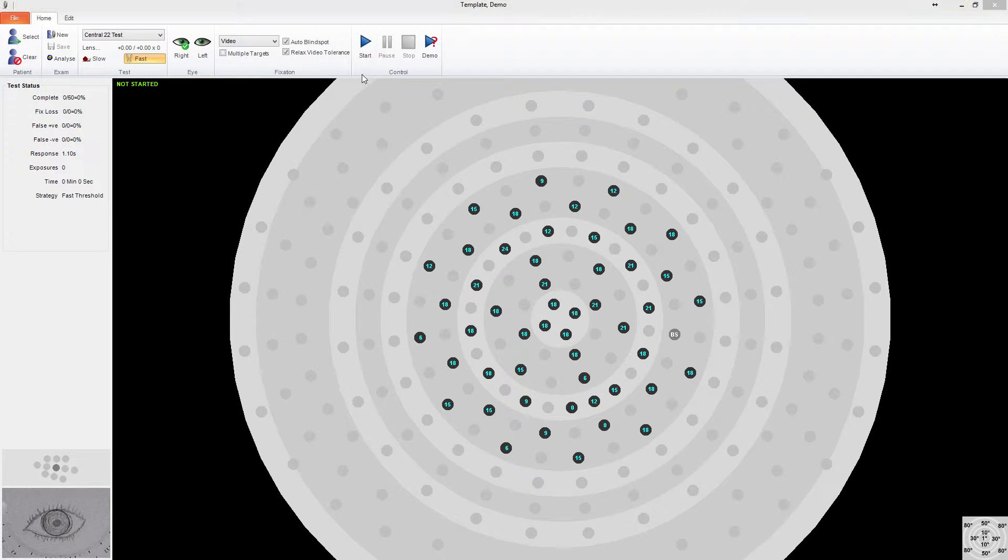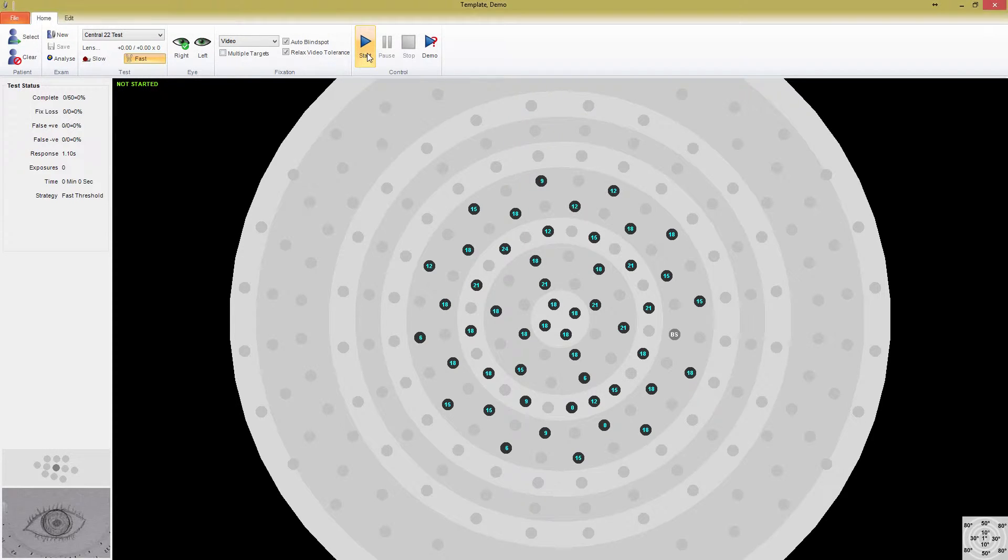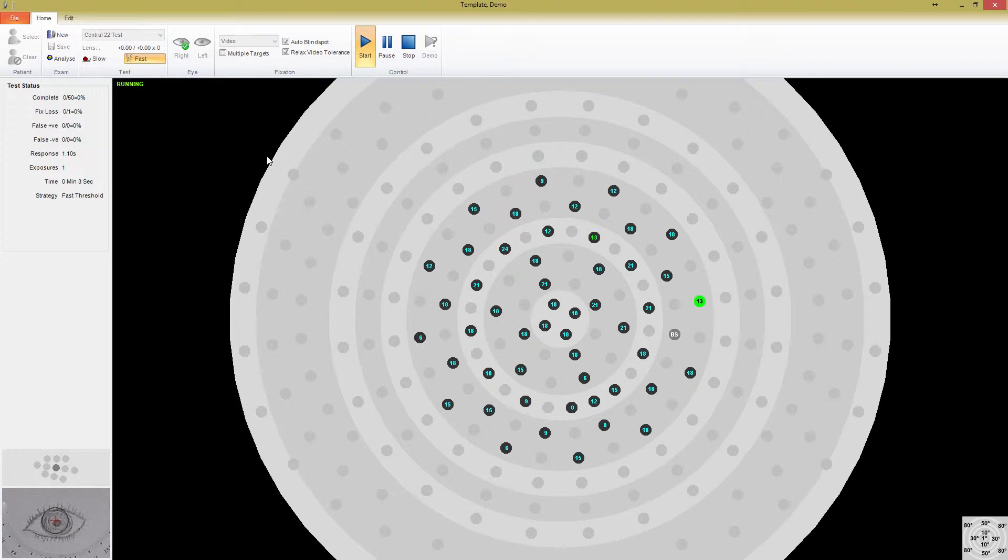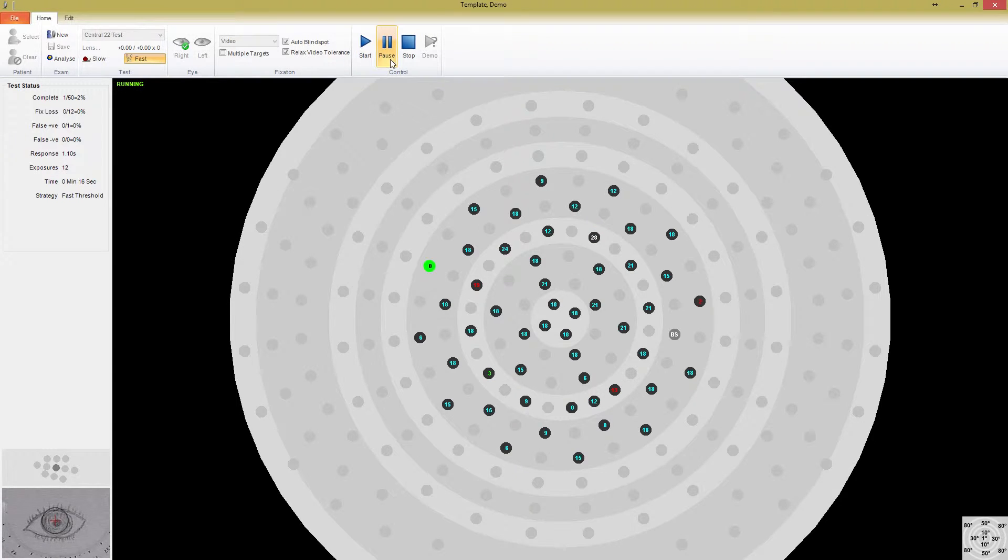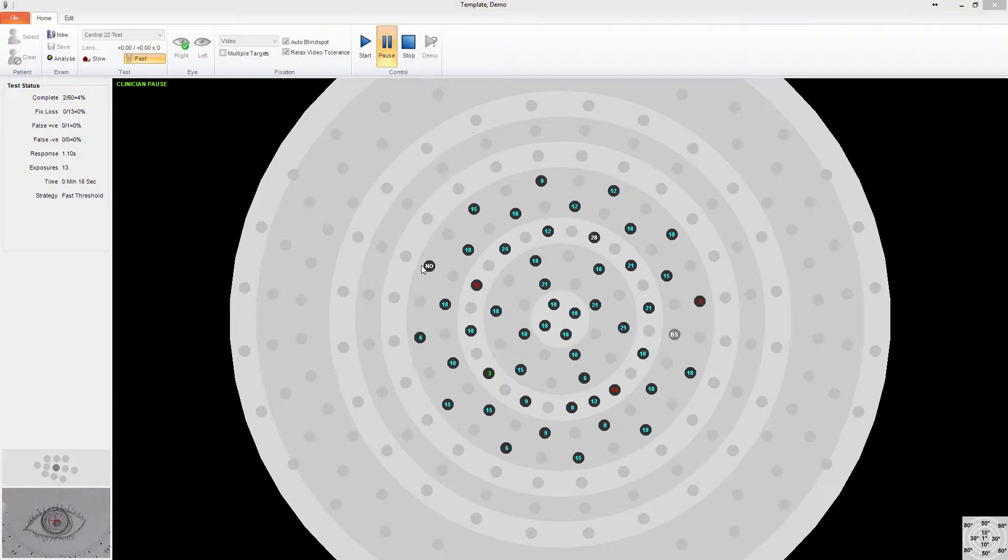I'm going to quickly start this exam and you'll see how the different numbers change. Notice at the beginning, the blind spot is tested even with video fixation monitoring turned on. With the exam paused, you can see that so far, of the points that have been tested, each one is now red, green, or white. I'm currently controlling the patient switch and I have only indicated that I've seen one point.